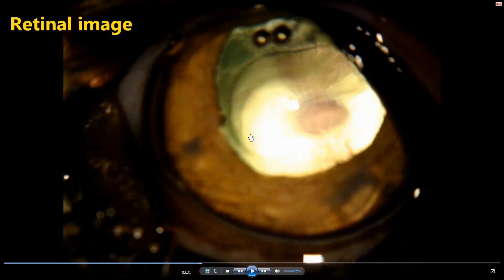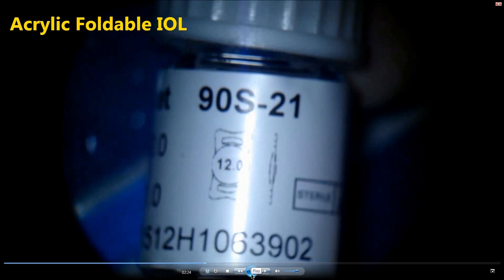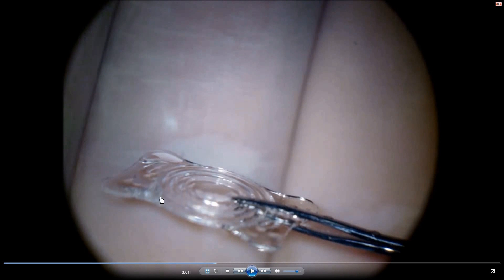This is the retinal image right after all the cataract material has been aspirated. This is the custom-made intraocular lens: the optic zone is 12 mm, the overall length is 21 mm, the diopter power is plus 30, and it is an acrylic hydrophilic foldable intraocular lens. This is what the lens looks like — a plate design with rings on the anterior surface that improve light diffraction, providing a better image projected on the retina.